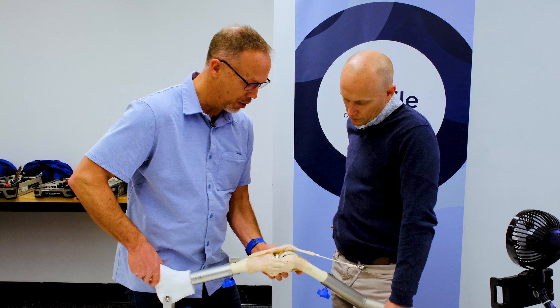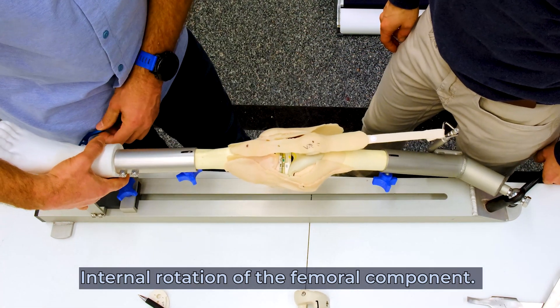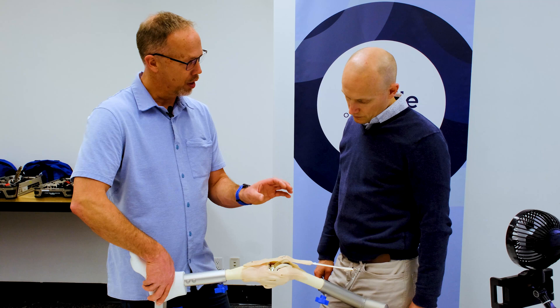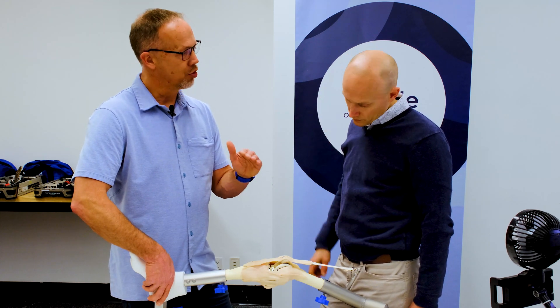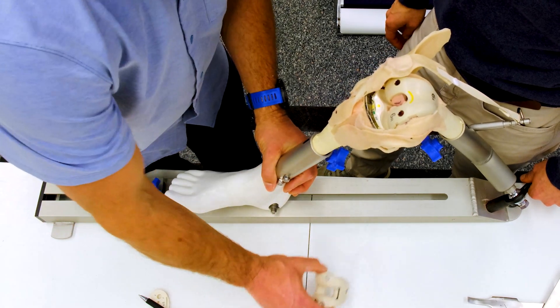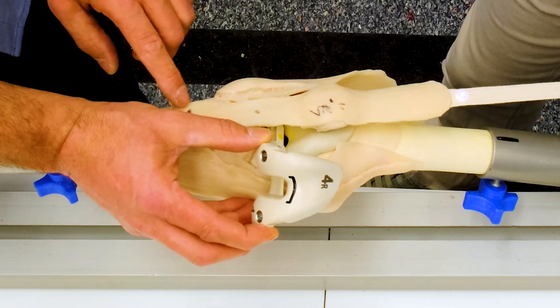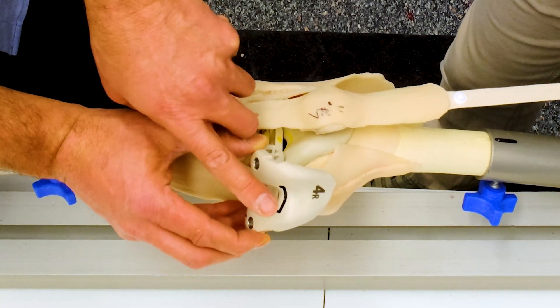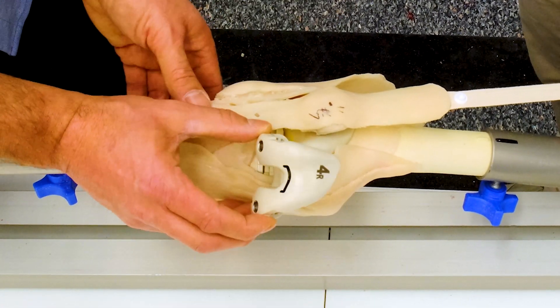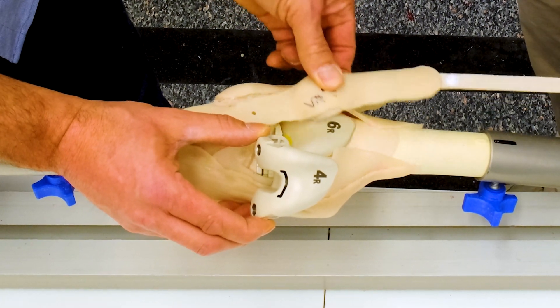Let's try to figure out what's going on and why our patella is not tracking well. The most common offender for poor patellar tracking is internal rotation of the femoral component — that we've referenced off the posterior femoral condyles and that wasn't a good reference, so the component doesn't match the trans-epicondylar axis. If you take a distal femoral component and internally rotate it, that angle increases. Anything that increases lateralization forces is a bad thing, and internal rotation of the femoral component can certainly increase the quadriceps angle and cause the patella to track laterally through an arc of motion.